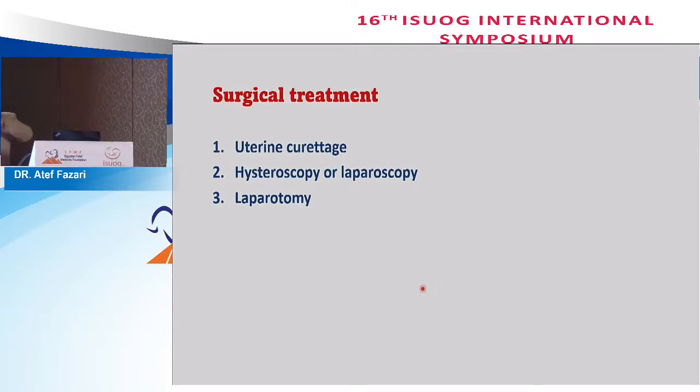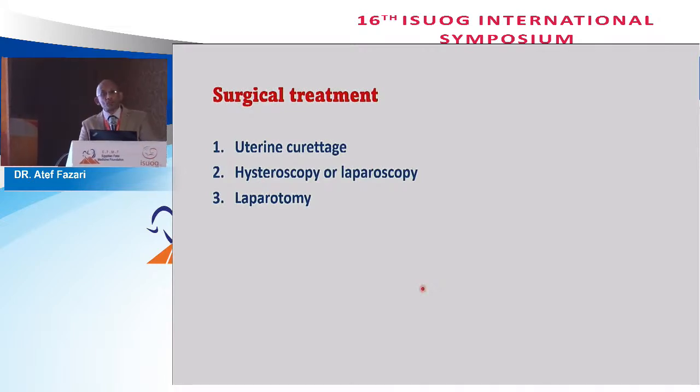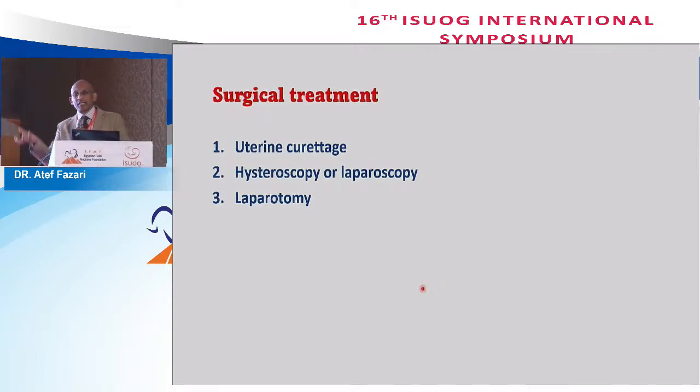You can walk and you can trace the margin and the size, and you can see the blood or whatever, maybe perforation and so on. Laparoscopy is good. You can sometimes operate, especially with those, or do some sort of resection for that affected site as a niche. And laparotomy is definitely the solution whenever we fail any one of them.